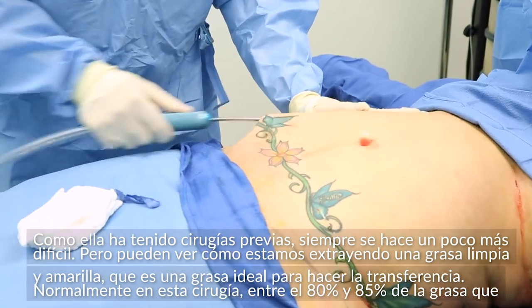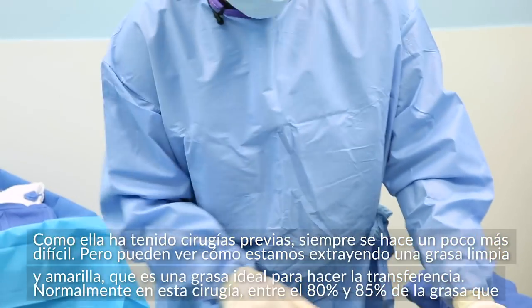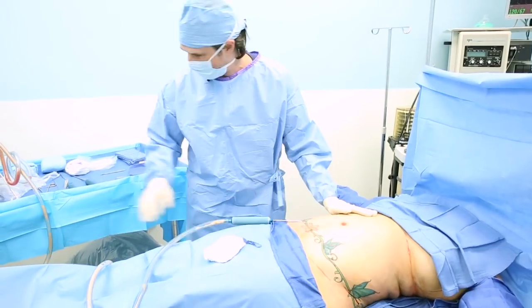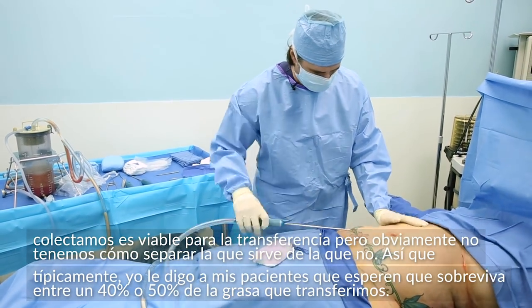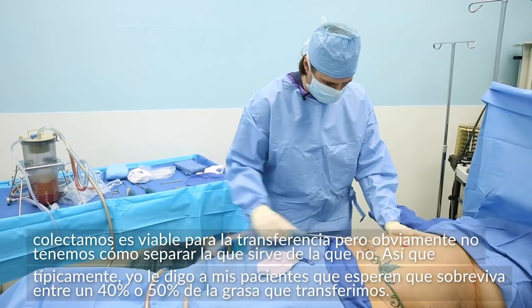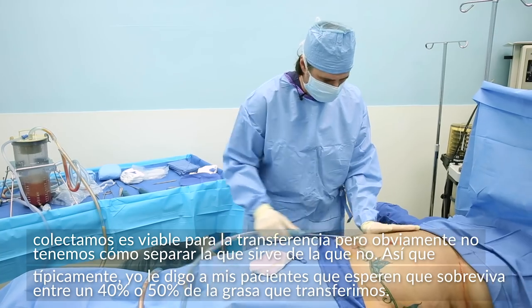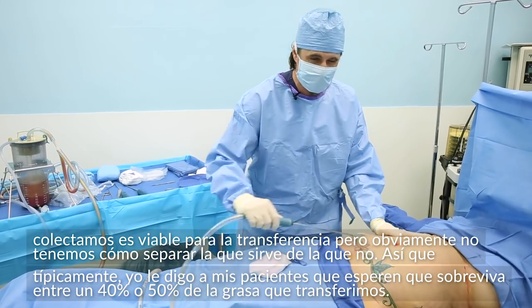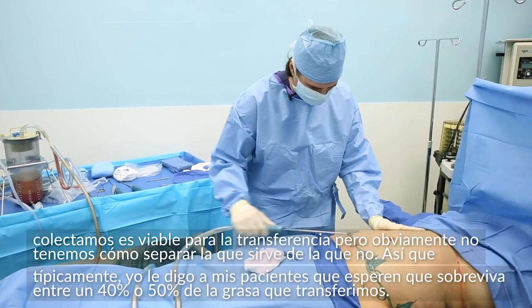Typically in a fat transfer, out of all the fat we collect, approximately 80 to 85% is viable for the transfer. We can't separate the good ones from the bad ones because they all look the same. So typically I always tell patients to expect somewhere between 40 and 50% of the fat that I transfer into the patient to survive.